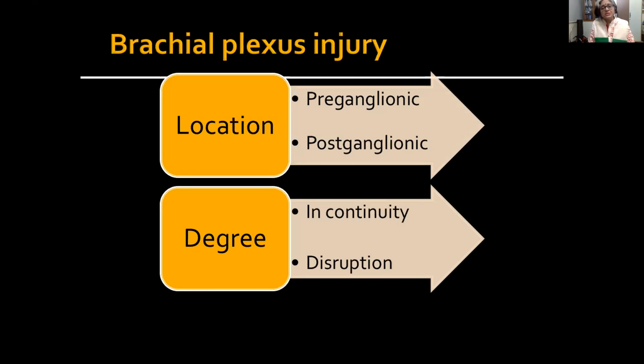The other situation is obstetric palsy, Erb's palsy or Klumpke's palsy. But frankly, we do not get too many referrals for that in our practice. These babies are not scanned for brachial plexus because they already know there is a brachial plexus injury. But later, when they plan the surgery for the glenoid version for rehabilitation, at that time they send us for shoulder scans. We do not image the brachial plexus of babies for obstetric palsy much. There would be a few referrals sometimes.